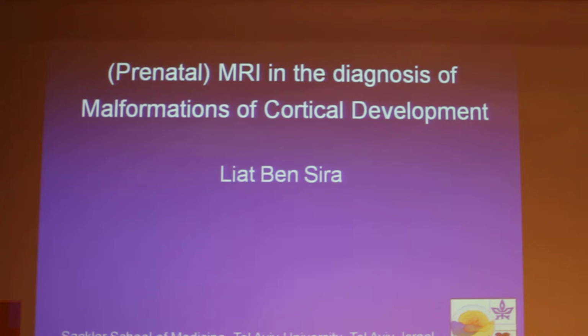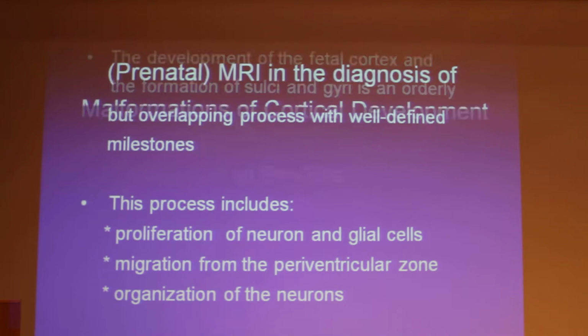So to all of you who are not doing neuro, and I know there are many people who are not doing neuro, I'm just going to give a couple of things to look into, and just to even see how you can go ahead with doing it. It doesn't mean that you have to know everything that's going on, but this is more of our experience.